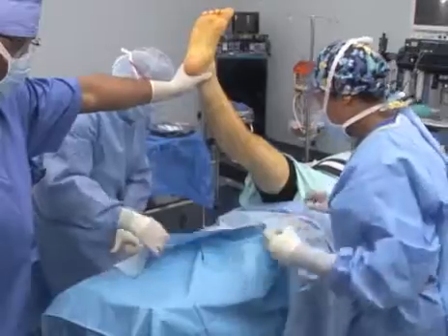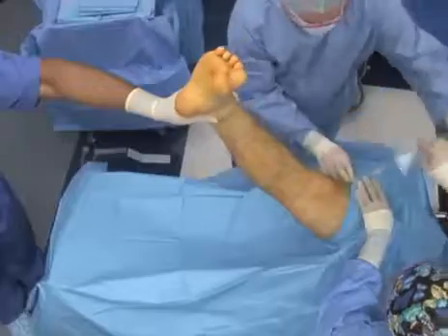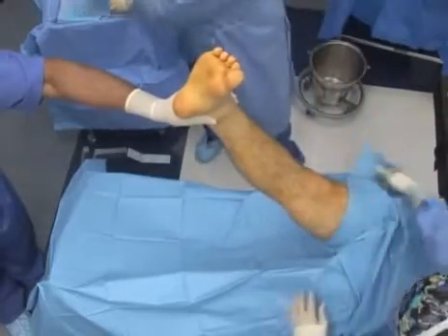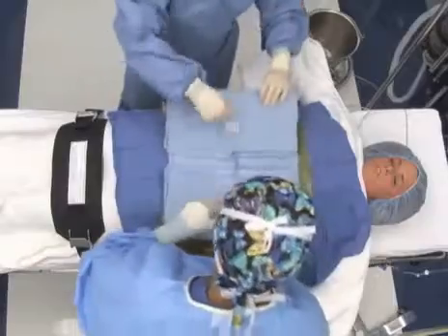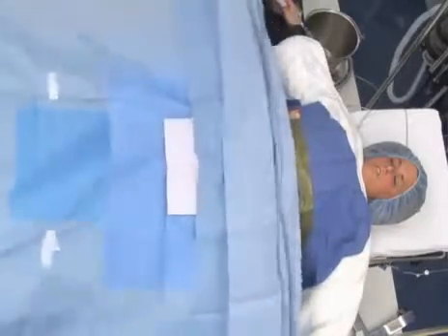Drapes are large sheets of impervious material or bonded fabric designed to fit the contours of the body. They provide a large sterile surface on which to work, as well as a barrier against the non-surgical areas of the patient's body underneath. Sterile drapes also produce a moisture barrier between the patient and the sterile field.